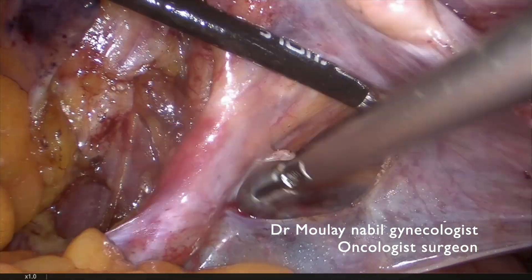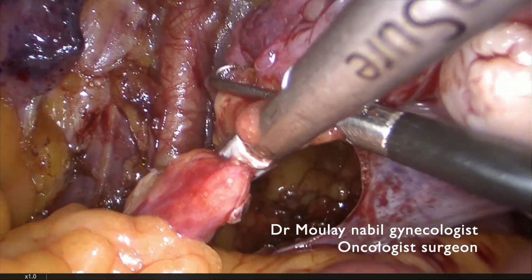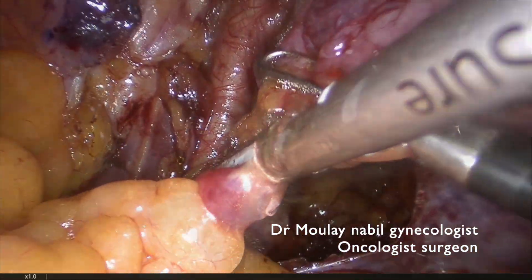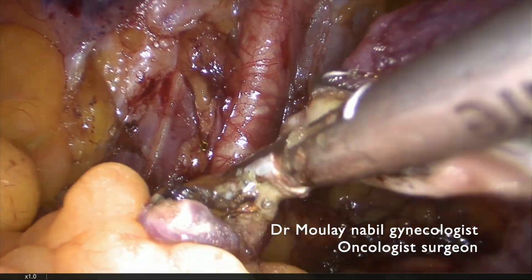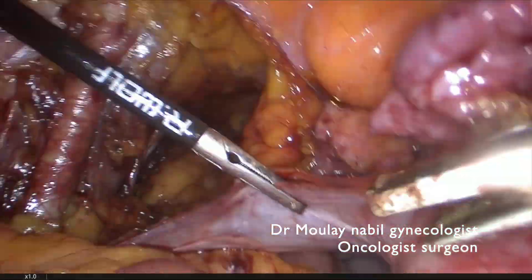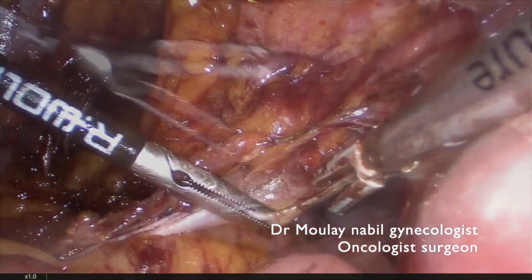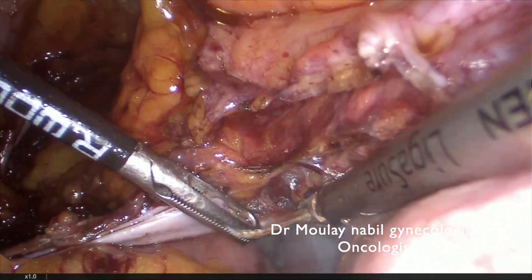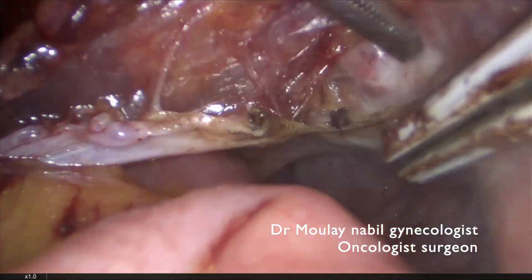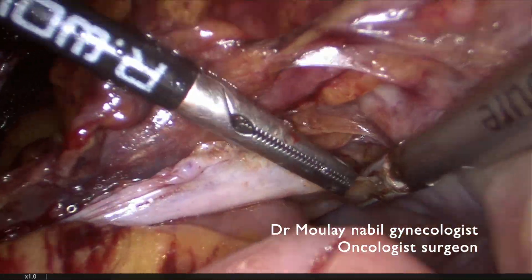We will show our technique for total hysterectomy in a fatty patient — the Clermont-Ferrand technique. We open a window below the IP ligament and ensure the hemostasis 2 cm before cutting this huge vascular element. The second step is to cut the posterior leaf of the broad ligament until we arrive on the upper part of the left uterosacral ligament. At this level we take care of the deep uterine vein. You can see the uterine artery and the deep uterine vein.